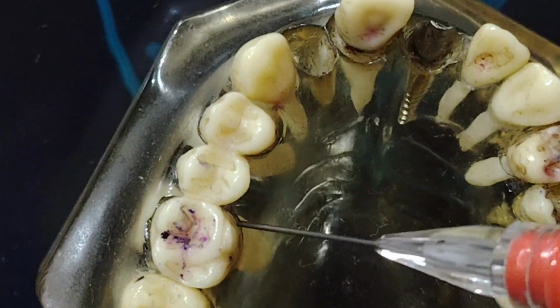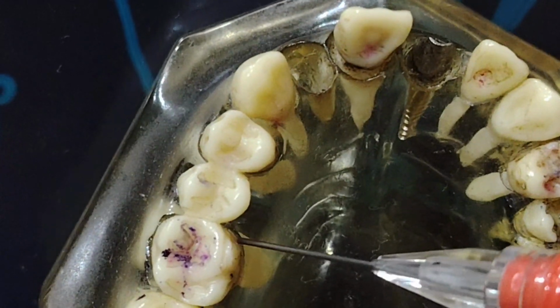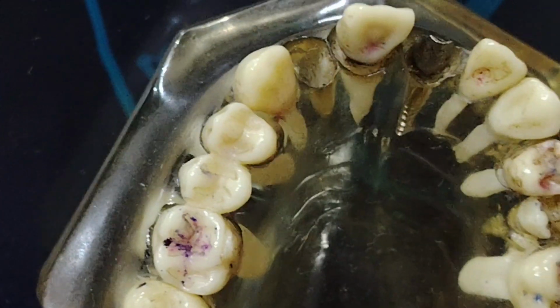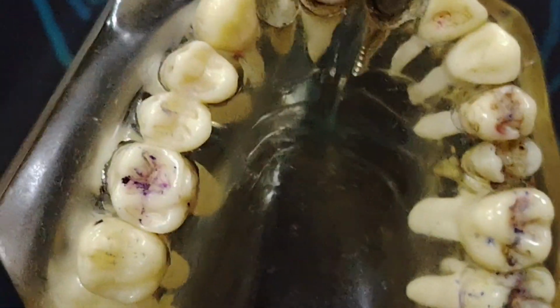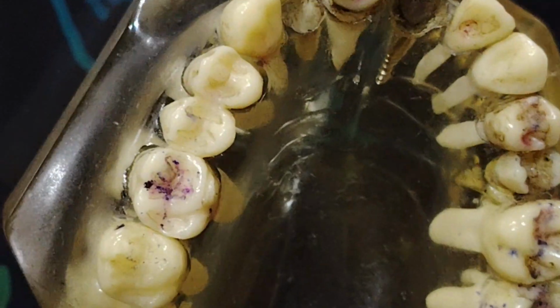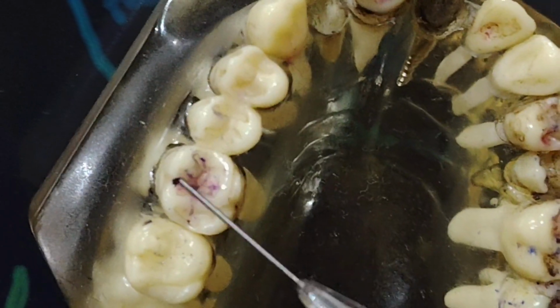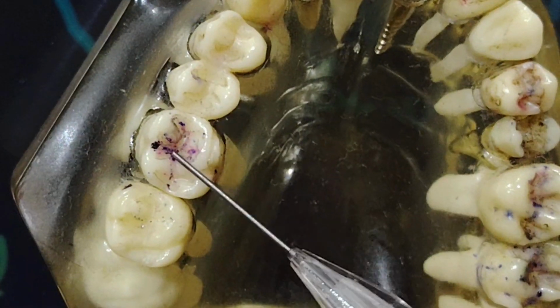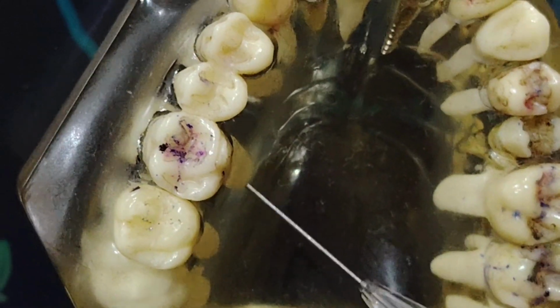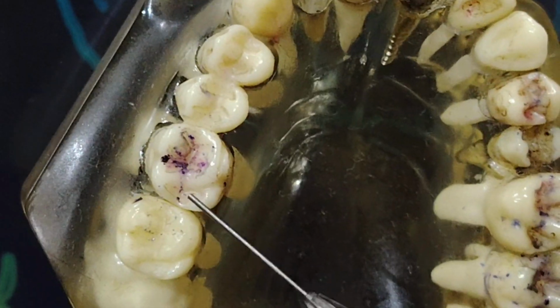As we know, we have to go till the CEJ, not beyond that. There is where we can find the pulp roof, the roof of the pulp chamber. As this is the mesial area, mesially only we will locate all the canals. We don't need to cross this. Crossing this part is not required.